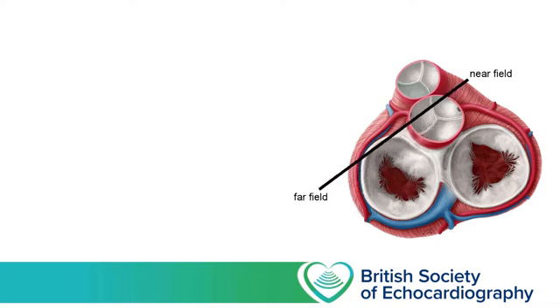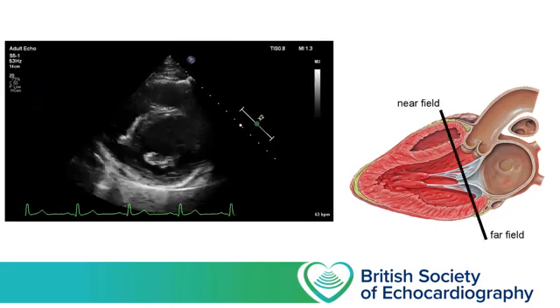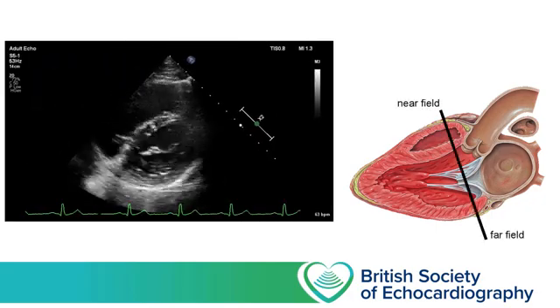Doing so will make your imaging sector move anteriorly towards A1P1. Once you've moved beyond the mitral valve in the anterior direction, lift the body of the probe such that the imaging sector moves posteriorly, down through the centre of the valve, and beyond A3P3. Whilst it's important to pan through the valve in 2D imaging, it's particularly important when you're using colour over the valve, and you're assessing for regurgitant jets which may well be eccentric and away from the centre. We next encounter the mitral valve in the parasternal short axis at the basal level, and here we can see the mitral valve en face.